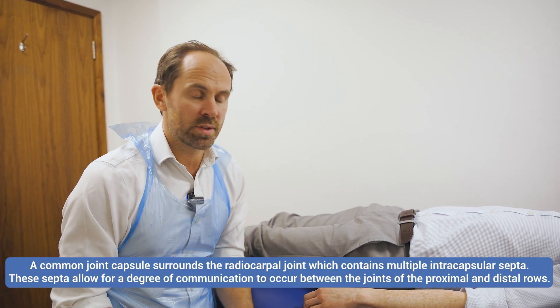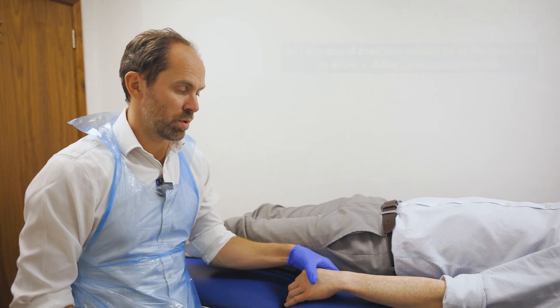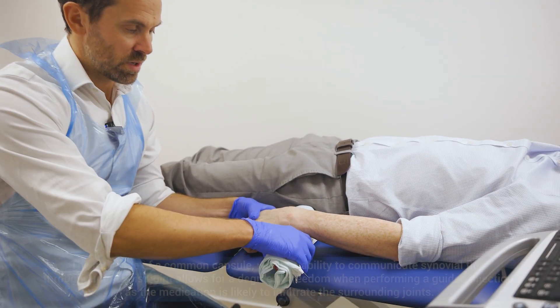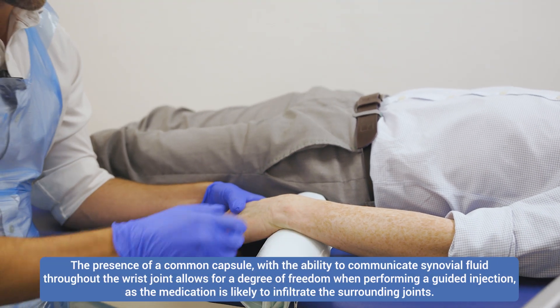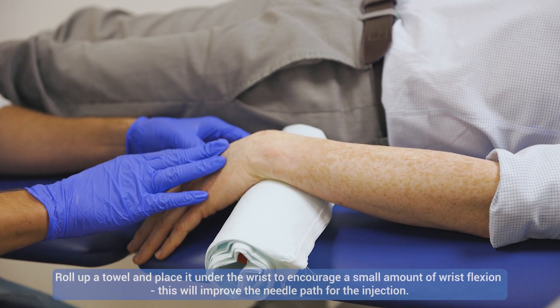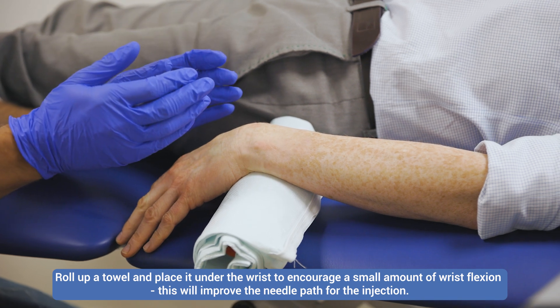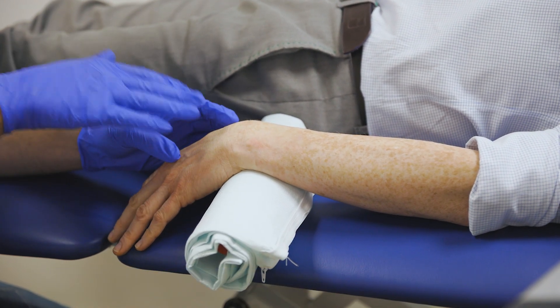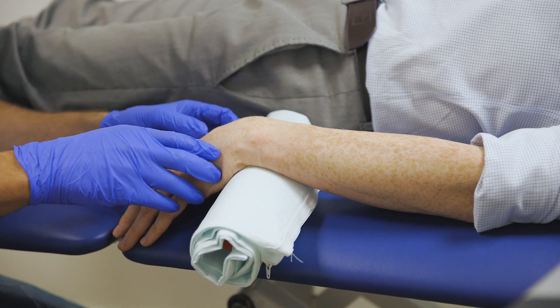What we find really useful is just to put the wrist into a little bit of flexion. You can just use a towel or something that's obviously clean, just to put the wrist into a little bit of flexion, which will open the joint up a little bit. That can help not only with the visualization but also to get the injectate into the wrist.